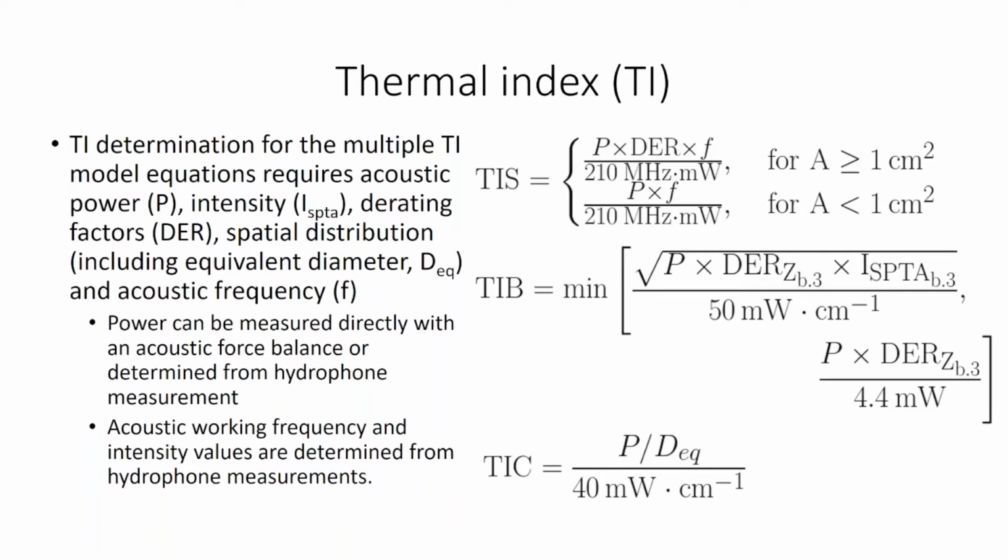These slides were added primarily to convey the complexity of the determination. The TI process is well documented in IEC standard 62359 and its references.